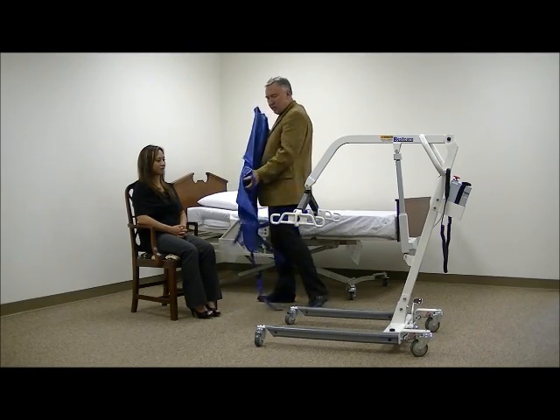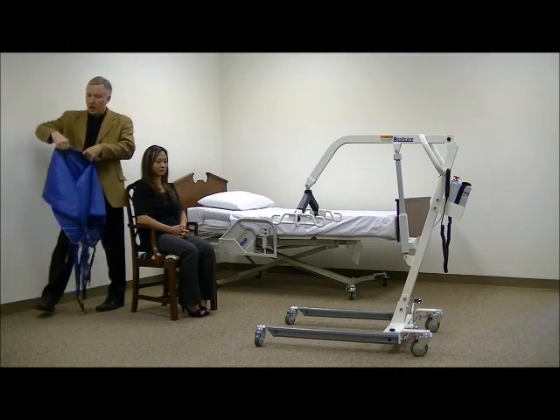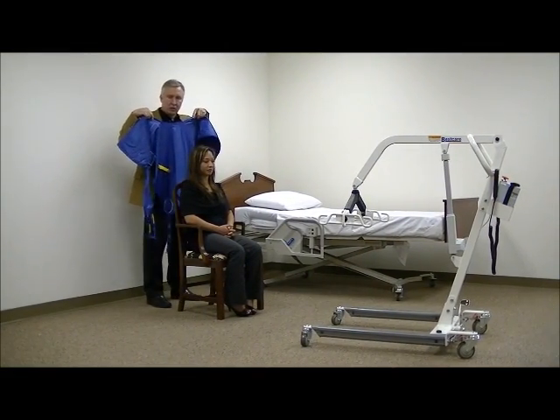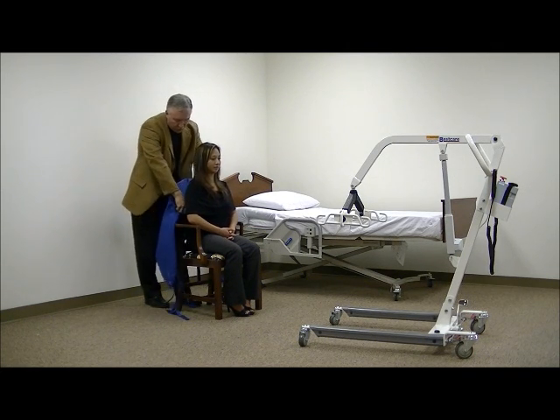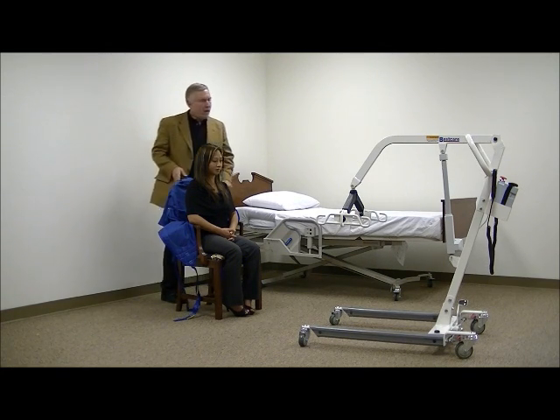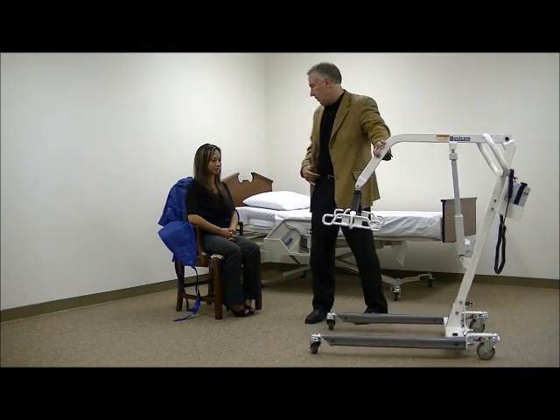So here's how we apply the sling. We're going to take that horseshoe and we're going to hold it upside down like so. We're going to hold it with the straps facing the patient right now. Then we're going to take the bottom part of this horseshoe and we're going to tuck it down until the bottom part of the horseshoe touches the chair. Not any further. We don't need to put it underneath the person's bottom. We just want it to touch the chair.